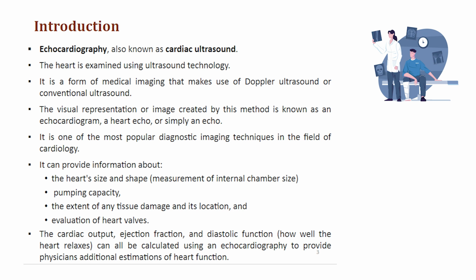It can provide information about the cardiac output, ejection fraction, and diastolic function, that is how well the heart relaxes, and this all can be calculated using an echocardiography to provide physicians additional estimations of heart function. The Swedish physician Inge Edler is recognized as the father of echocardiography.